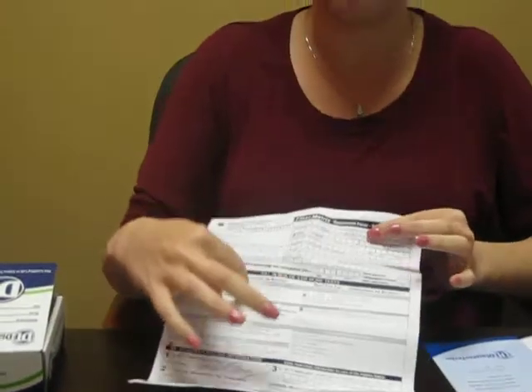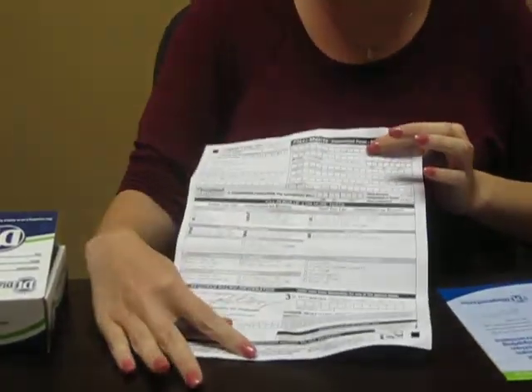It has the paper that we already put the information in on what test needs to be done. So all I need you to do is, when you get home and you're done with your samples, put your name and information in this gray area right here. Just this top part has your name and everything. The most important are your name, your phone number, your address, and your date of birth. Also, down here underneath all the information, it says, I completed my samples on, and the day that you did it.